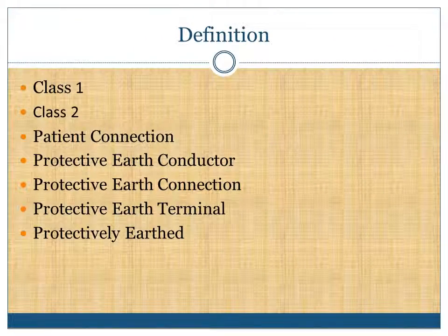Other terms related to the leakage current are as follows. Insulation Class 1: a term referring to electrical equipment in which protection against electric shock does not rely on basic insulation only, but which includes an additional safety precaution in that means are provided for accessible parts of metal or internal parts of metal to be protectively earthed.